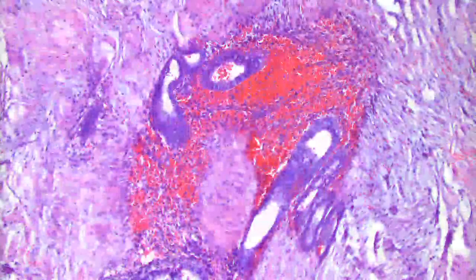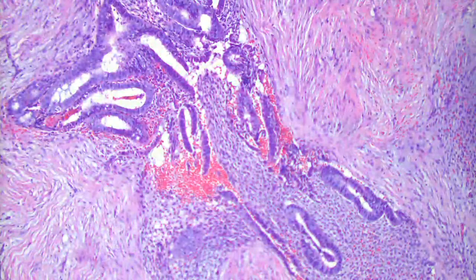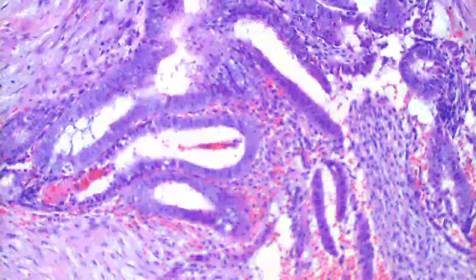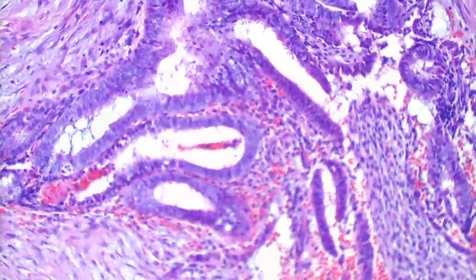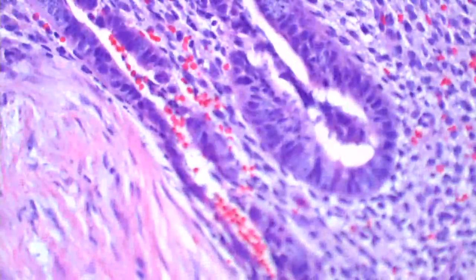Yeah, that's a good thought also. Usually, I haven't seen too terribly many of those. Yeah, I was looking it up, and there's not very many. They're usually pretty solid neoplasms. You probably wouldn't get multiple small duct-like glandular aggregations in that. If it were a metastasis, it'd probably be one really solid metastasis. You do have a couple mitotic figures in here, though. This is a proliferative epithelium. But that is the right answer. This is cutaneous endometriosis.